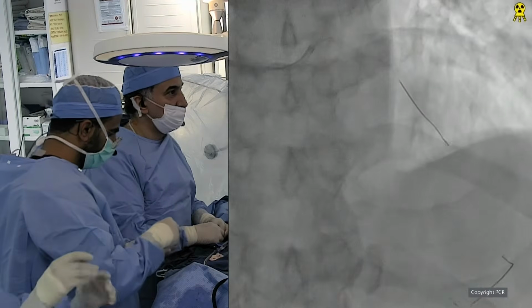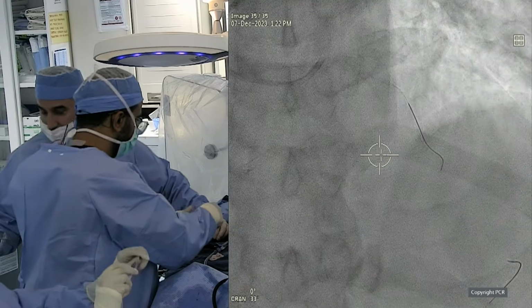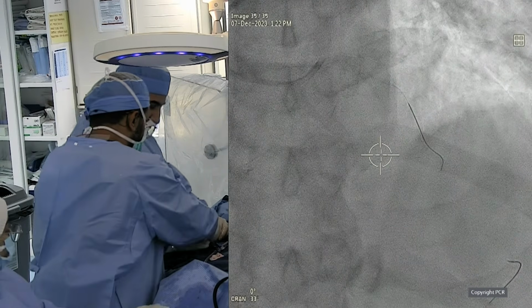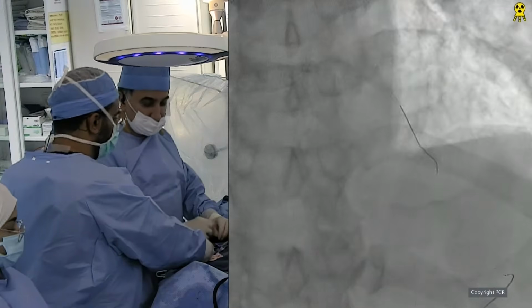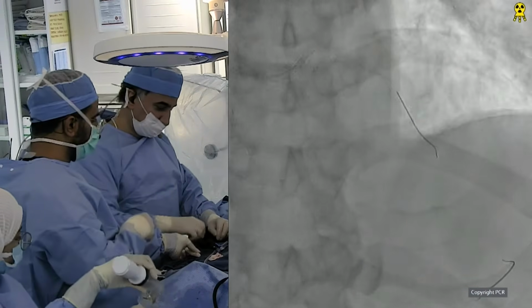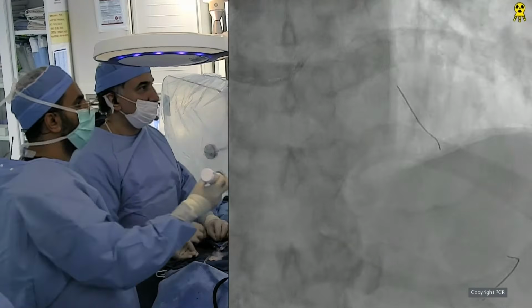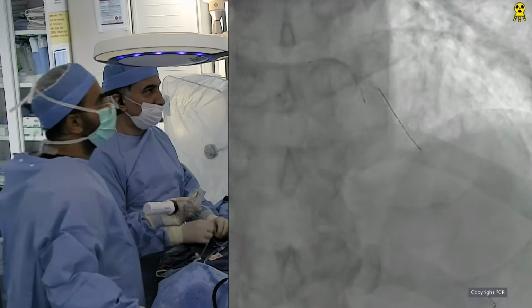Yeah, I think it's always give and take. With the femoral, you have a slightly higher bleeding risk, but you might have a much improved backup from the radial. You can go up to 7 French with the Glidesheath Slender or sheathless. But of course, it's always easy to talk about options when you're not standing there trying to get the stent in the LAD.